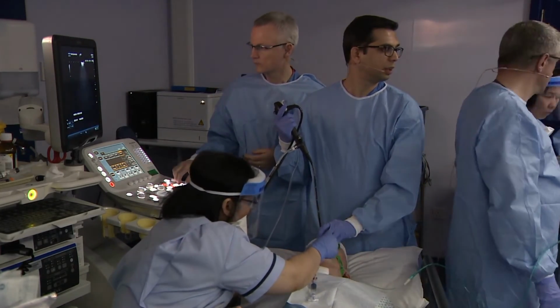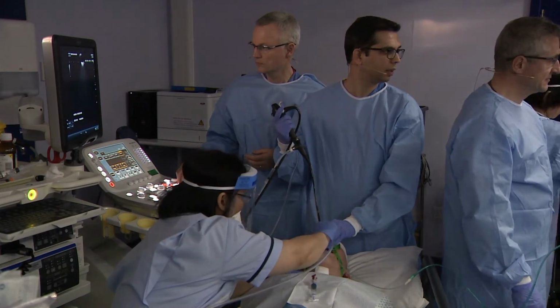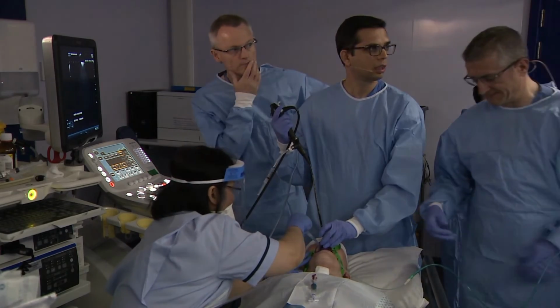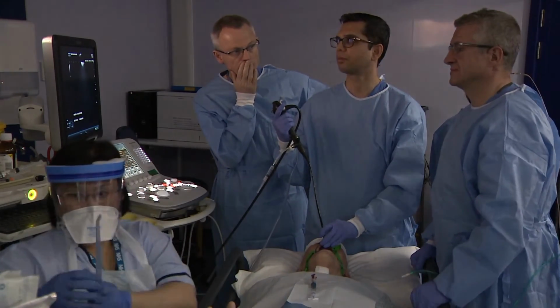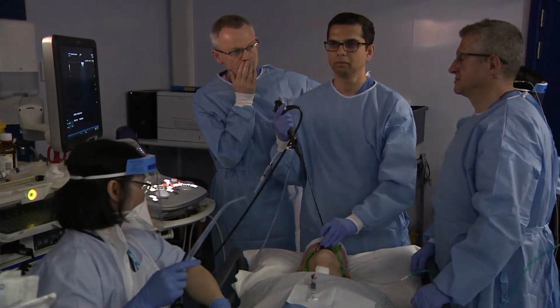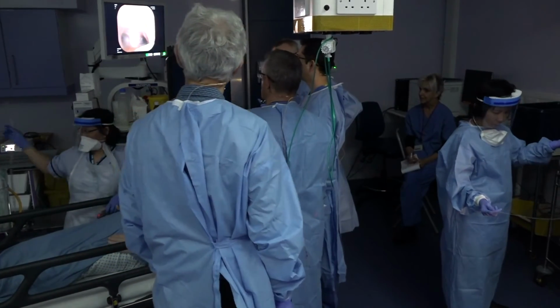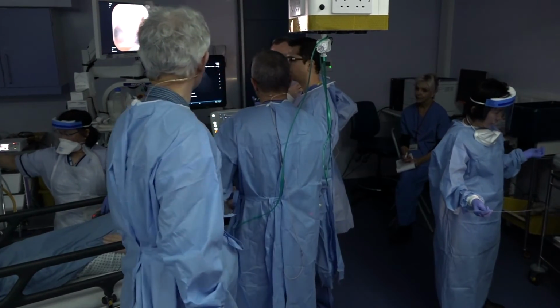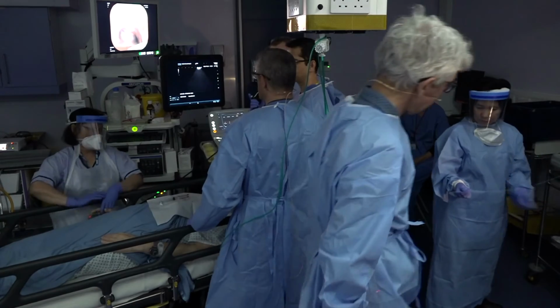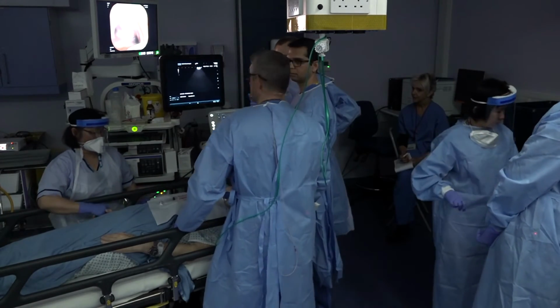Sorry, what did you say, Tony? Do we need to switch to ProCore, or are you happy? I don't think the ProCore will help. I think it's the heterogeneity of it and the focal necrosis that is the issue. So I don't think you need a cutting needle. It's a question of the variability of the material itself. Okay. So would it be best to think about more material from the periphery, maybe more agitations? What we could perhaps do is try a different node target.